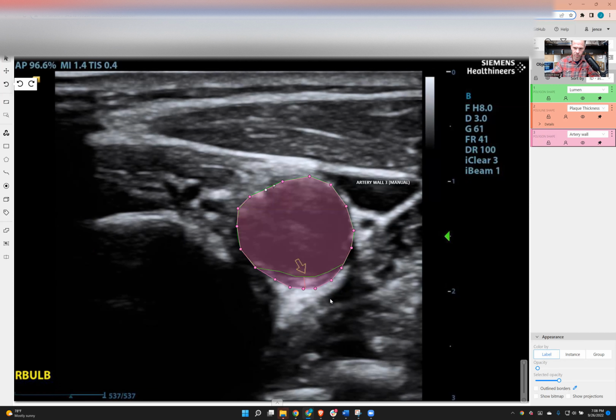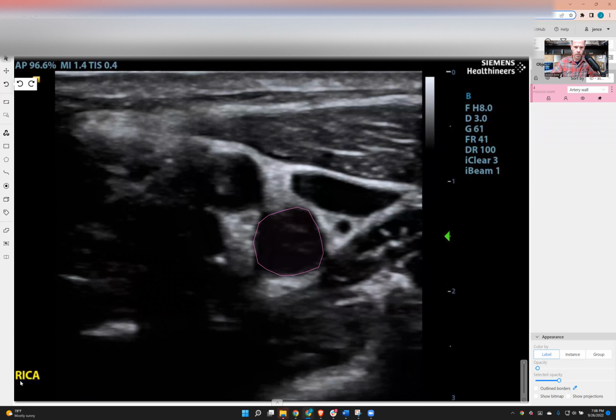I've measured it. I've measured how big the artery is. I know how big the blood flow is. And that atherosclerosis area is measured from the outside to the inside. We're getting better at mapping that in real time. More to come on that. We're mapping the right internal artery.